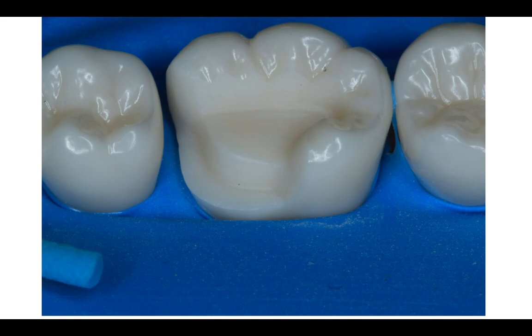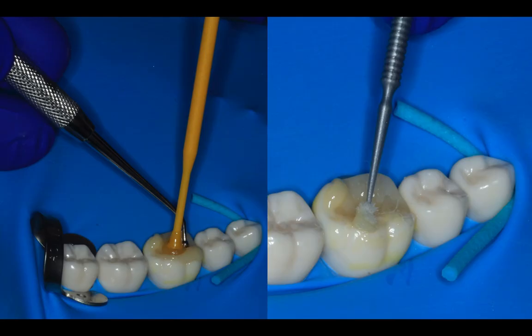And well, at the end, we ended up having the restoration, and we add a lot of cement, and we cemented, we clean the cement, and all of the cementation protocol, we are going to have a full class for that. You don't have to worry about this for now. It's not part of your quiz, which, by the way, is going to have onlays and digital dentistry, and the lecture that I gave you, which has been uploaded in Canvas since two weeks ago.